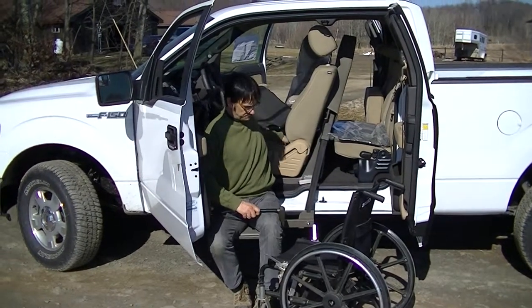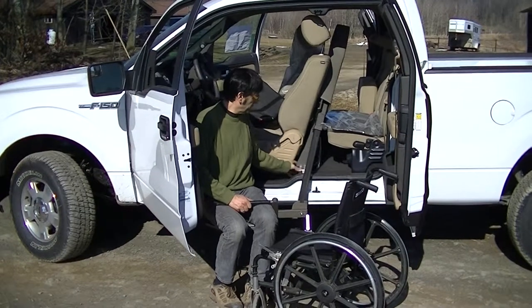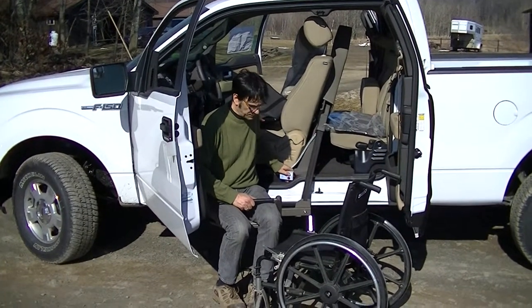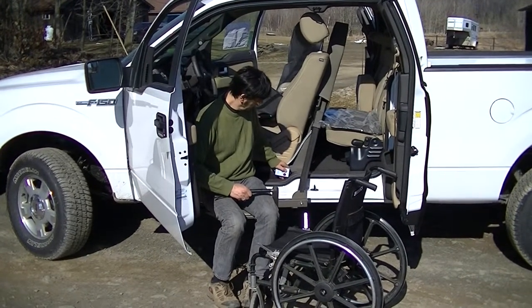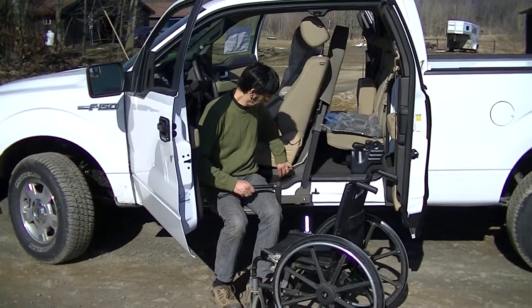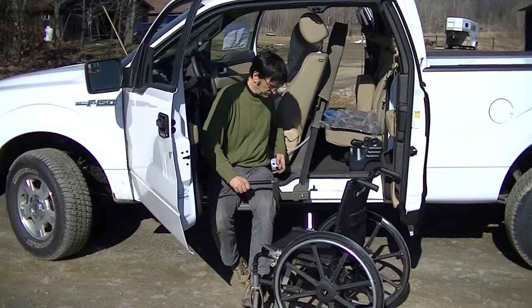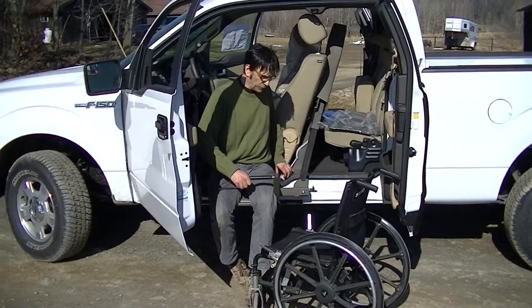First we put the cushion in and position ourselves to face inside the vehicle. We're going to raise up a little bit, and once we get to an appropriate position, we'll fold the wheelchair up.